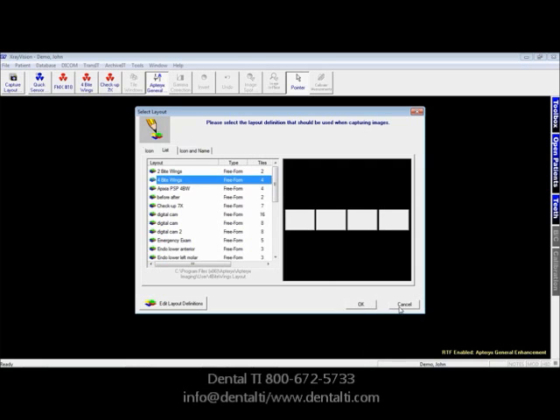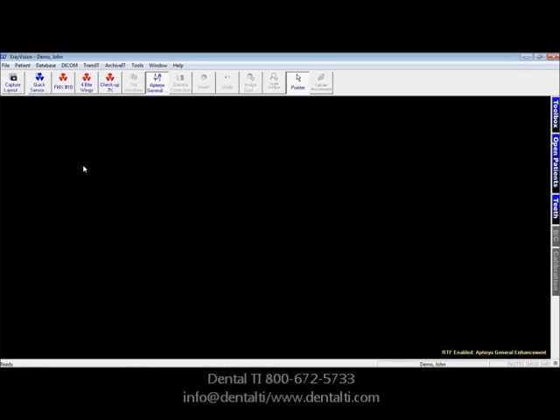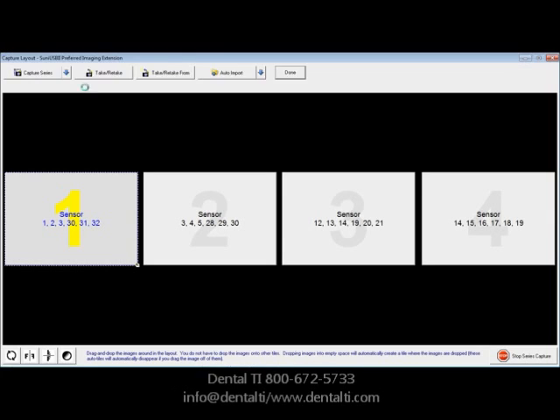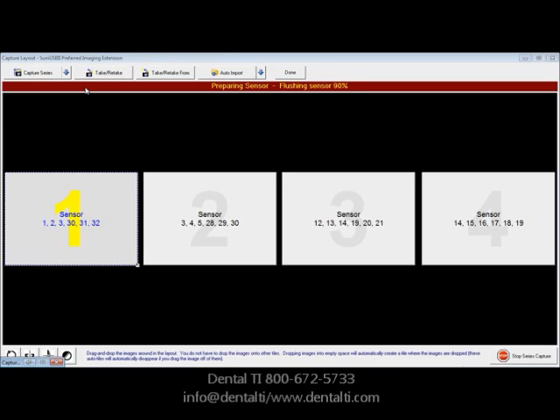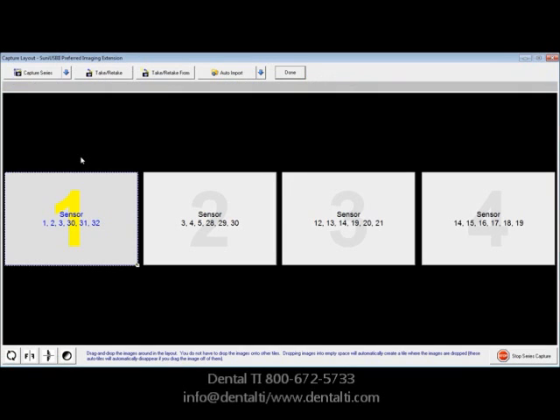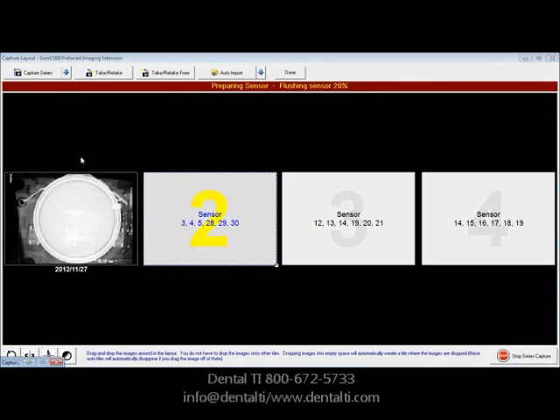I'm going to cancel that operation because we've created a shortcut to four bite wings on the toolbar that you could click, and it would automatically go to sensor ready. You'll notice the very first position, number one, is highlighted, as that's where you're going to take the very first X-ray. We'll go ahead and expose the key fob. You'll see it's processing the image, and it then moves on to position number two.